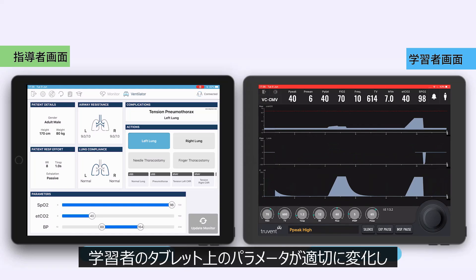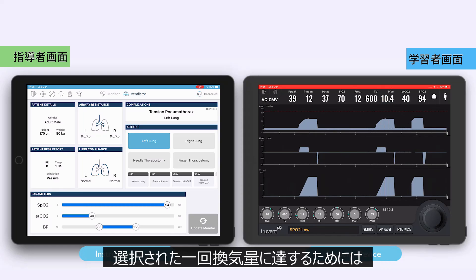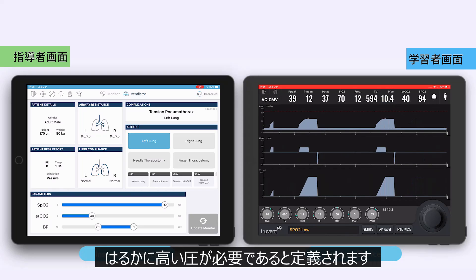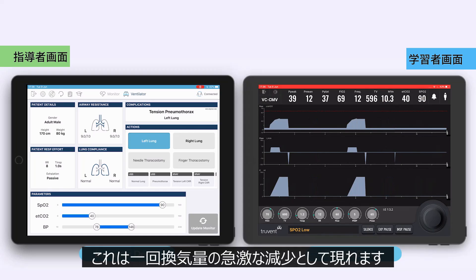Once this is active, the parameters on the student device change appropriately. The algorithm defines that in volume control mode of ventilation, much higher pressures are needed to achieve the selected tidal volume. In pressure control ventilation modes, this would manifest as a sudden reduction in the achieved tidal volumes.